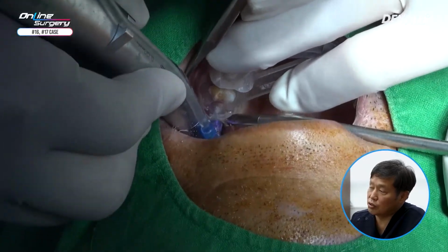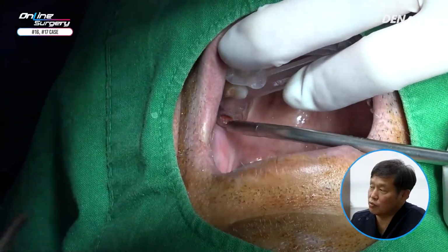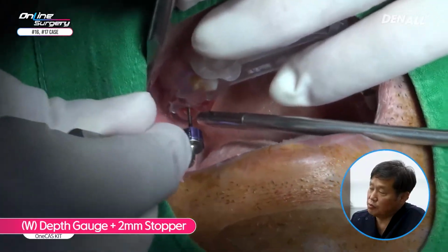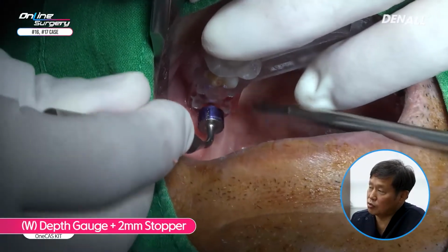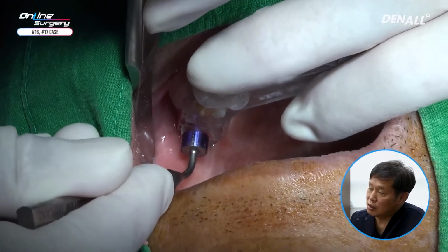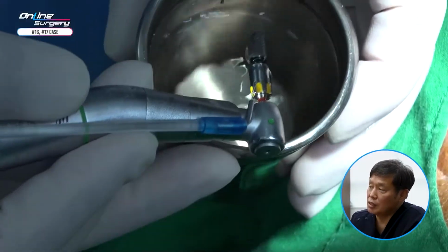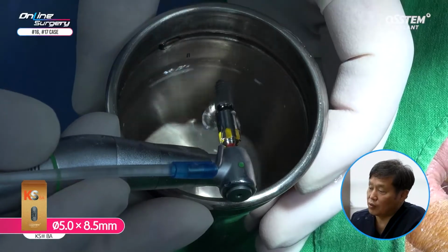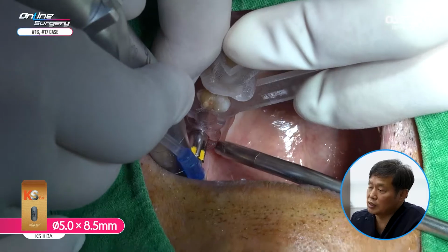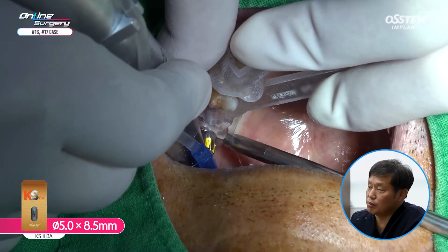In my case, with OneCAS, in the case of posterior, I assume this to be soft bone. So there should be a 1.2 millimeter gap. A 2 millimeter stopper is used to check whether there has been sinus floor penetration. You can see there is contact. At 8 millimeter, there is partial penetration, and at this stage, without further sinus membrane lift, KS3 BA 5.0 by 8.5 millimeter implant is placed.